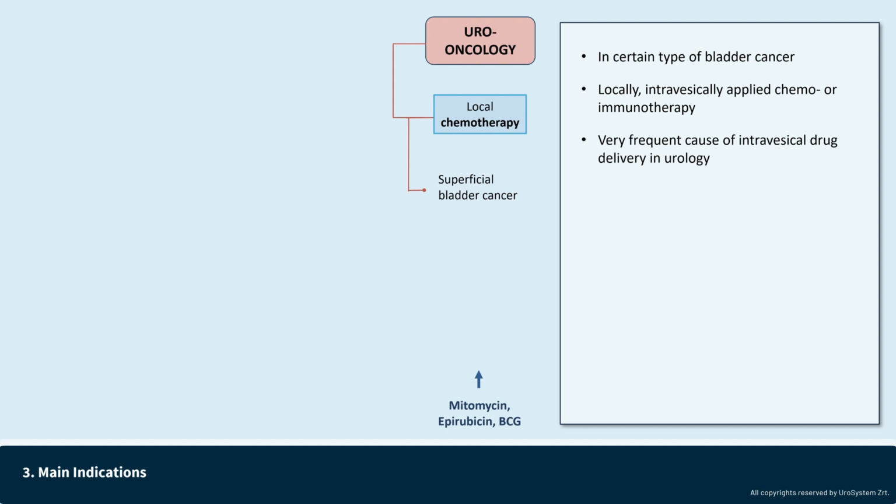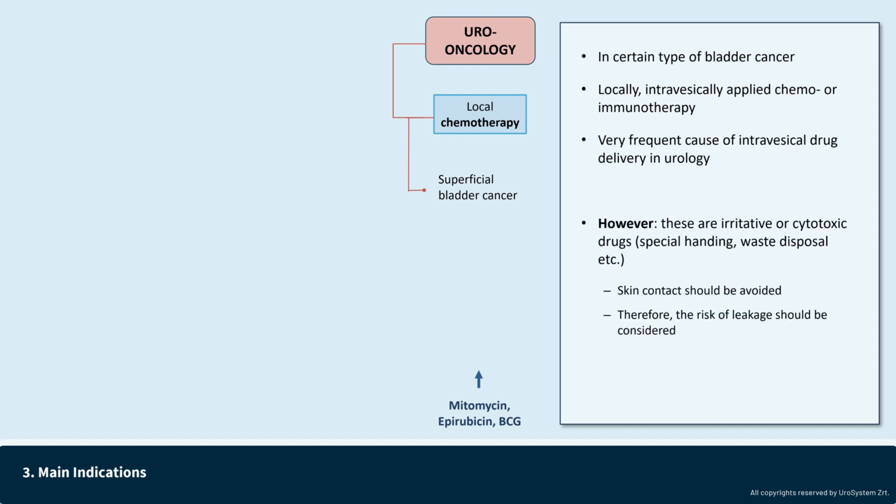intravesical drug delivery. An important consideration in this indication is, however, that these are irritative or cytotoxic drugs, which typically require special handling and waste disposal protocols. Therefore, unnecessary skin contact should be avoided with them. There is very limited data available on the use of UroDapter in this indication. However, the risk of leakage should be considered, and the use of UroDapter should be recommended only by experienced users.